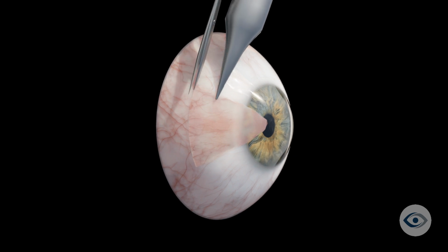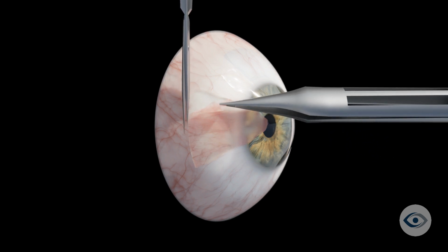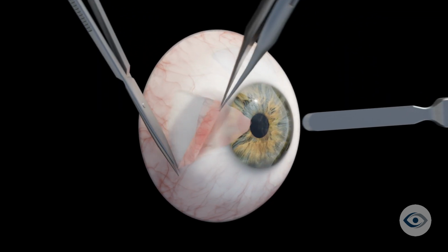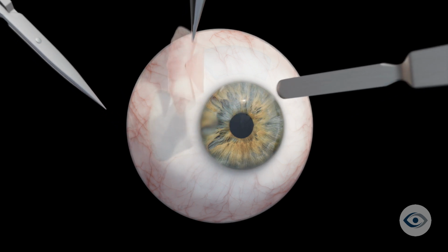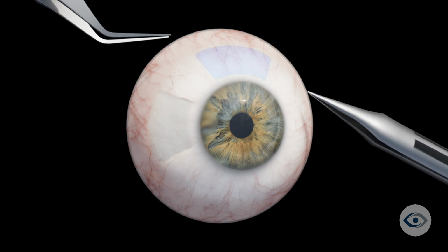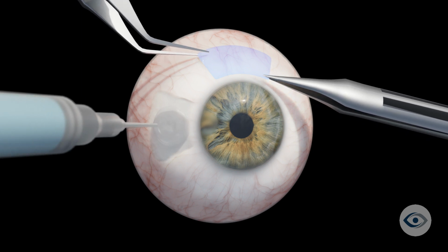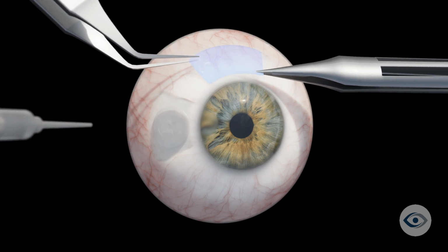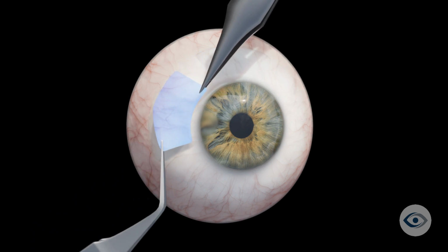Both the conjunctival and corneal aspects of the pterygium are manually removed from the surface of the eye using specialized ophthalmic surgery instruments. An area of healthy conjunctiva is then identified, typically from the upper part of the same eye. A graft is created using this tissue and is glued to the site from which the pterygium was removed, covering the exposed sclera, or the white of the eye. The site from which the graft is taken heals within approximately 1 week.